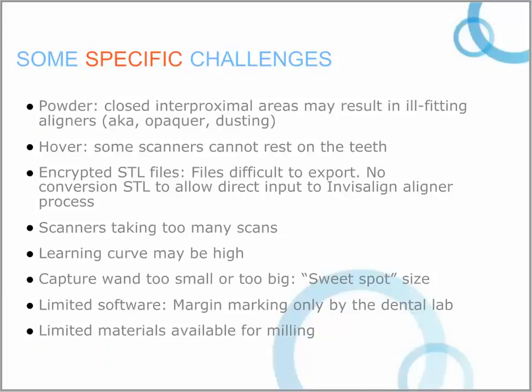Another issue is that some of the systems, especially the triangulation systems, require that you hover at a prescribed focal length above the teeth. And that hovering can be very fatiguing, and it also has a huge learning curve, making it difficult to transpose that information to an assistant or staff. I think it's important when you think about a different system that you think about a scanner that allows you to rest on the teeth. I've used most of the other systems and found that this feature of resting on the teeth is very important and, as I said, much less fatiguing.